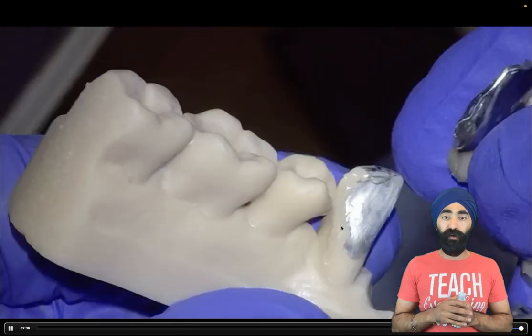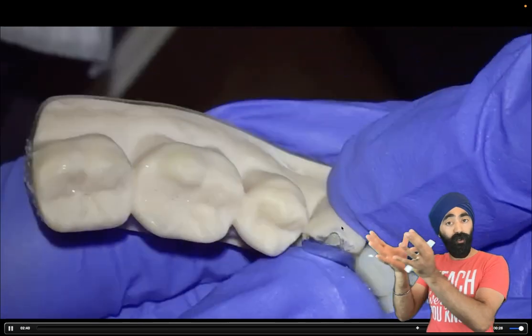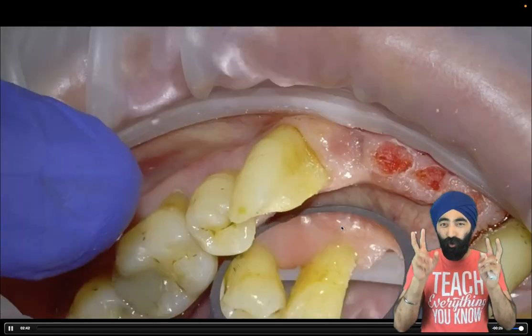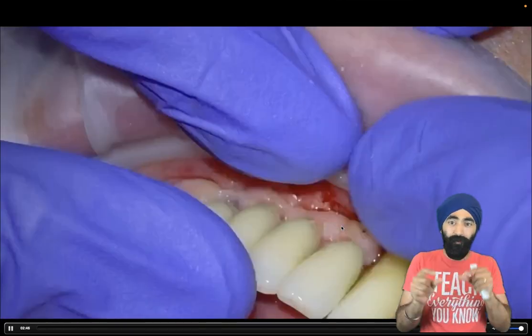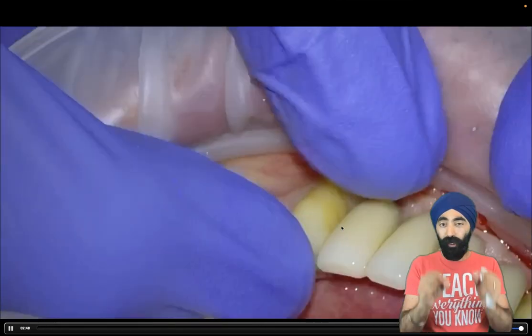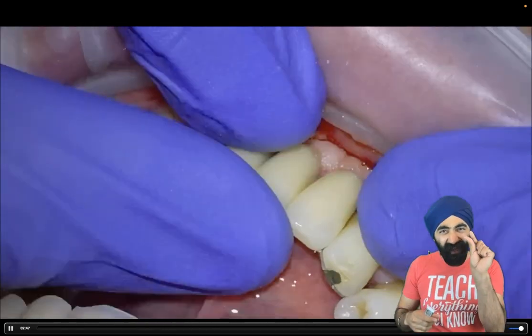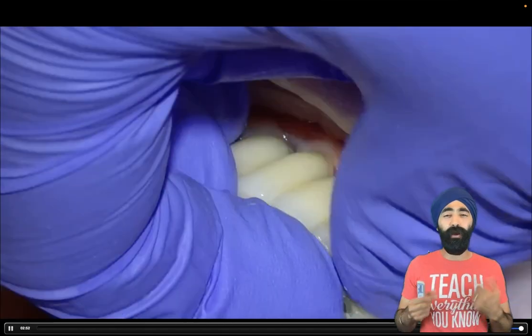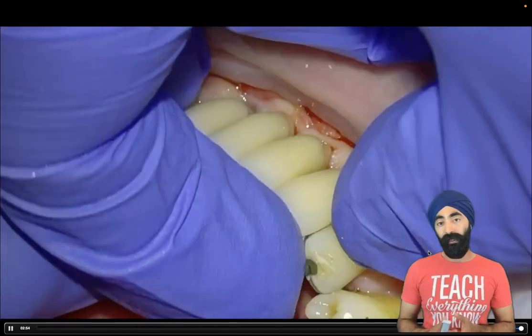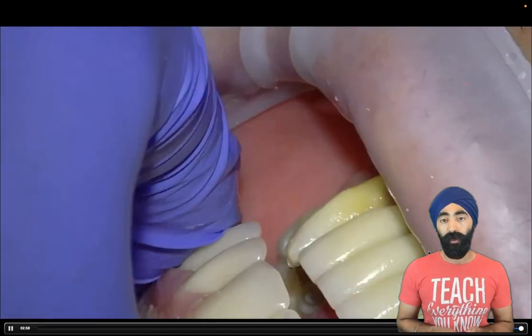I'm rehearsing on the model and in the mouth so that when I come to that critical stage of bonding, it's going to be familiar. I rehearse and I rehearse so I can make sure I get to the same place and get that feel of the bridge — how it's going to feel against my finger and thumb when I'm seating it, so I know if I've misseated it. I'm checking the occlusion lightly as well. We'll talk about that another time.